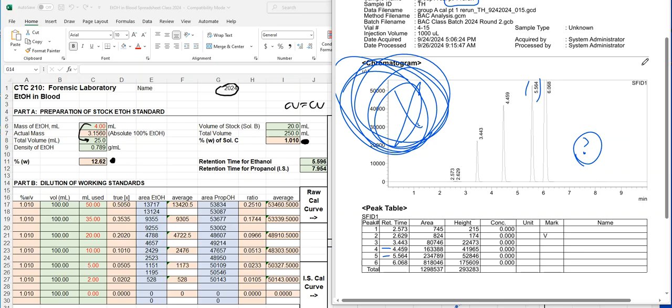They're not going to be doing fingerprinting. They're not going to be doing too much of blood identification or any of that kind of thing. It's going to be mainly the chemical-based tests that involve instrumentation, equipment, chemical reagents, and so forth. That's really our arena. And we leave the other stuff up to the biologist and the forensic analyst.